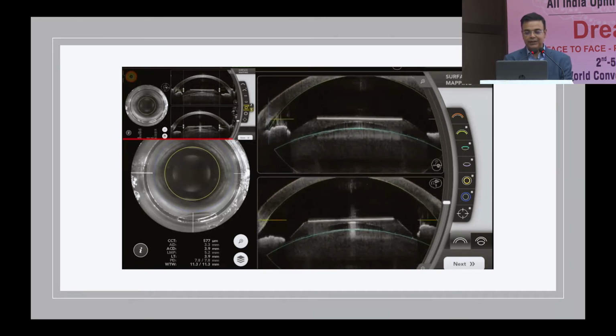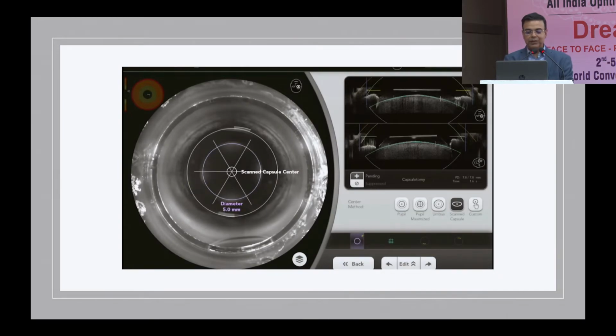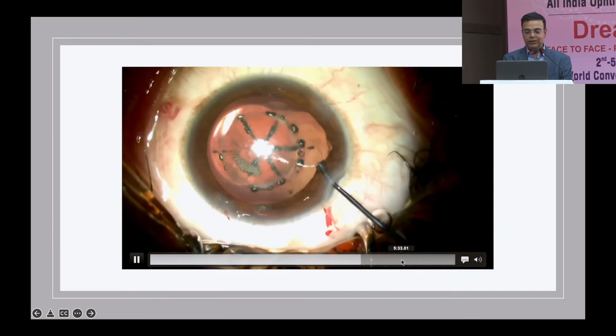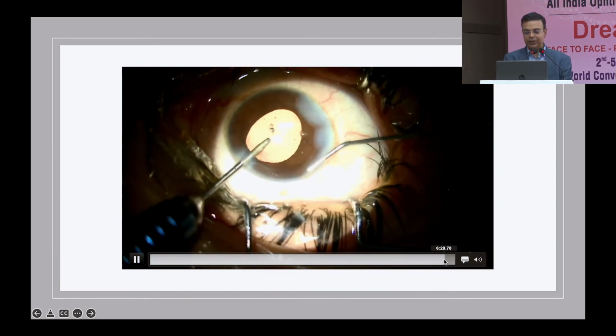So finally you can set the landmarks yourself, but you have to be careful that you set the posterior capsule and the anterior capsule, and then of course the capsulotomy becomes much easier as you fire this. And to cut the story short, we were able to do this well, and then the whole surgery was mostly uneventful and we could complete it. So this is a useful modality when you're in a situation.